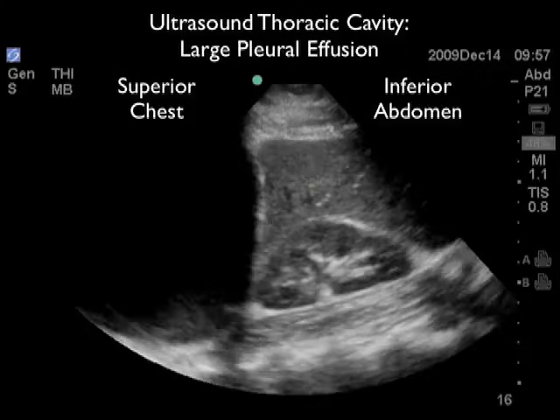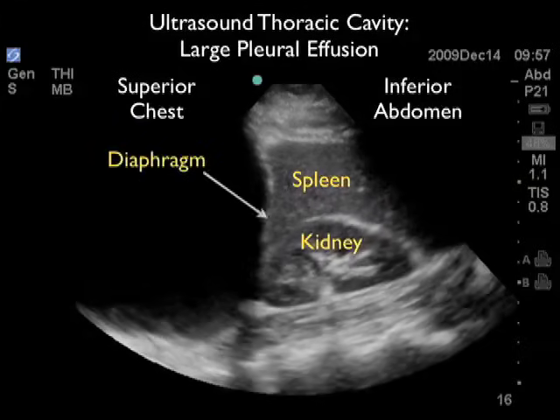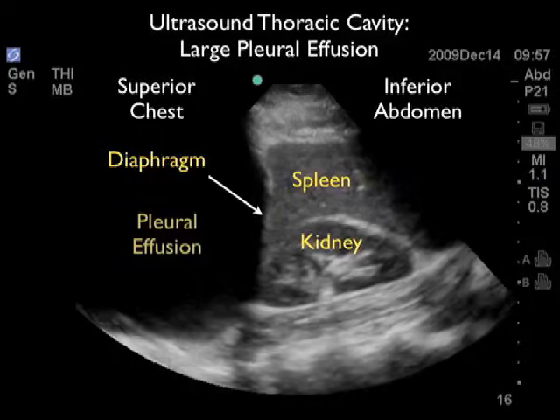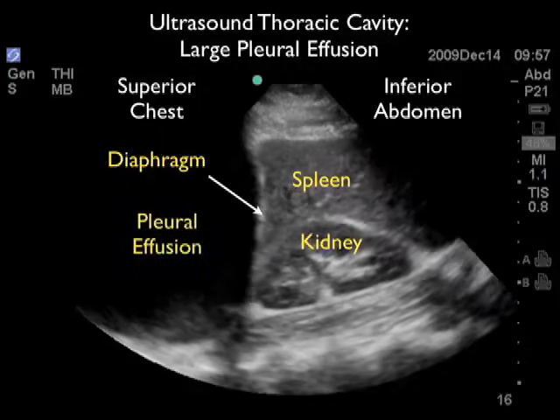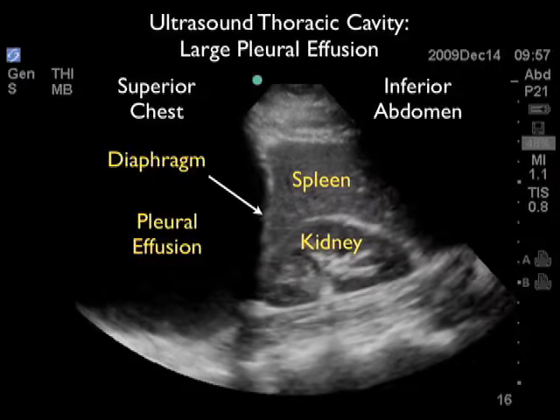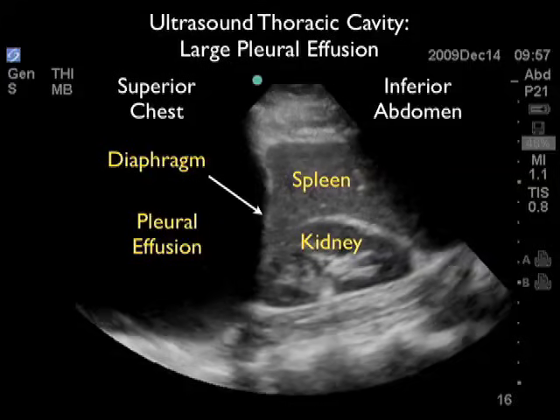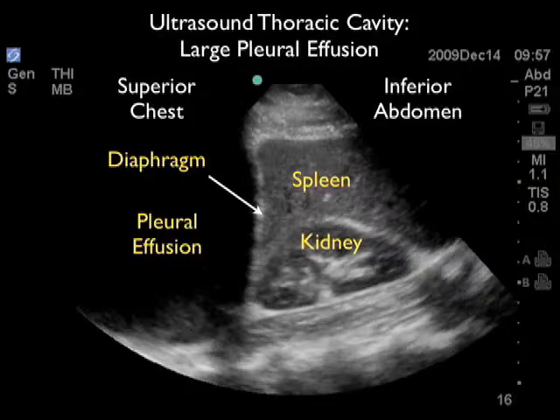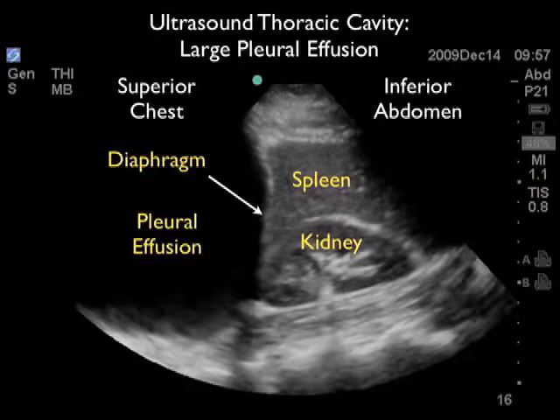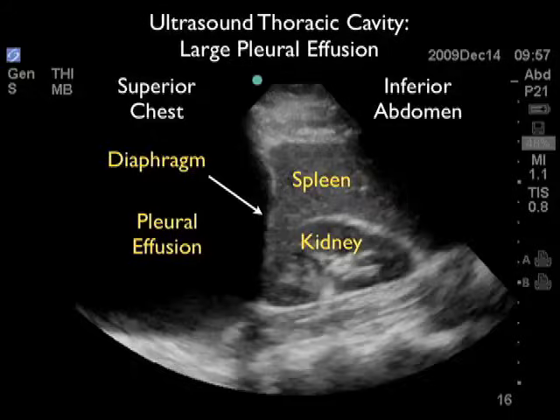We can angle the probe above the diaphragm to look for a dark or anechoic collection of fluid consistent with the pleural effusion. This is the ultrasound image that corresponds to the chest X-ray from the patient as we discussed in the beginning of the module. We have the probe positioned across the patient's left side of the chest, coming in with a probe marker towards the patient's head. We can see here superior towards the left and inferior towards the right. We note the spleen and kidney inferior in the abdominal compartment, and we see the white line that is the diaphragm moving up and down as the patient breathes. We note above the diaphragm, superior in the chest cavity, the presence of a large dark or anechoic collection of fluid consistent with a very large pleural effusion, and we fail to appreciate any lung within this pleural effusion.